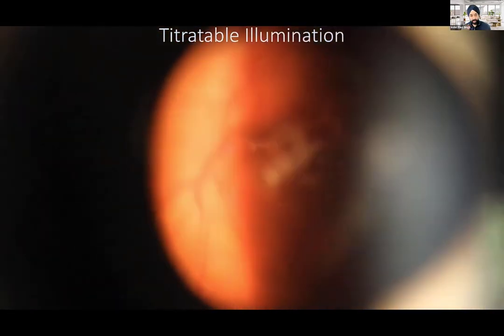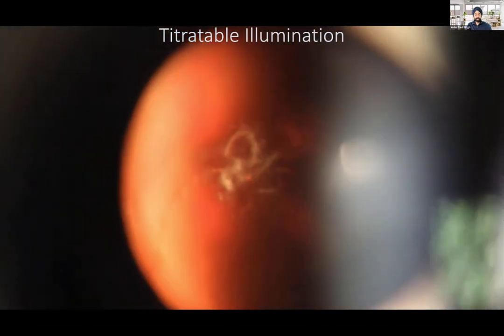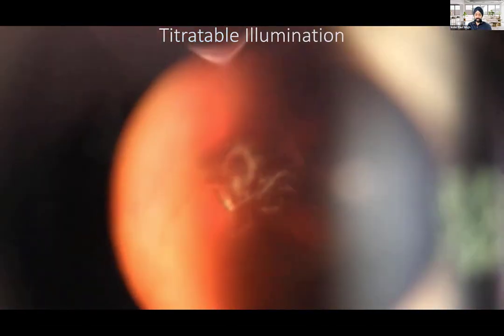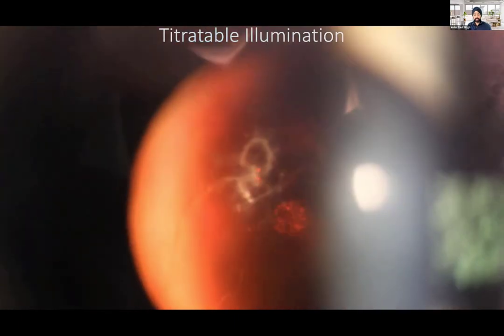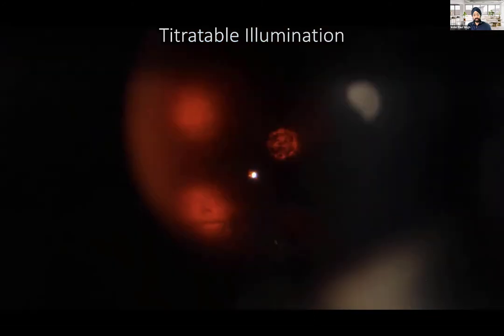And anytime you're doing vitreolysis, we keep talking about this in every one of our seminars, give yourself the time to know where you are. So you see, I'm going about 3 or 4 times, confirming I'm not near the lens capsule, the retina is out of focus, I'm truly in the middle of the vitreous. And I can start firing the laser. And it does, as Dr. Brasse mentioned, break them up. There is some vaporization occurring, but it doesn't necessarily mean they're going to be vaporized all at one time.